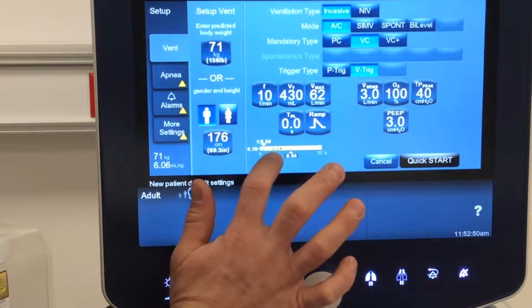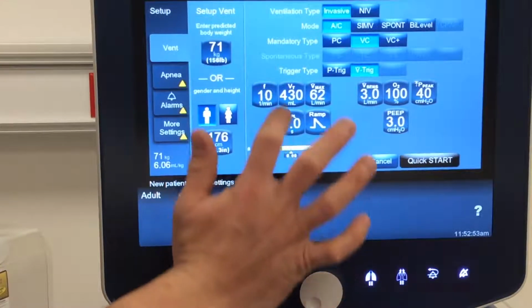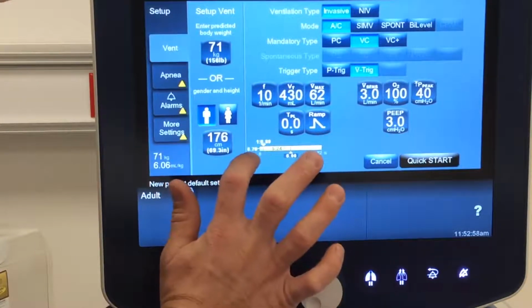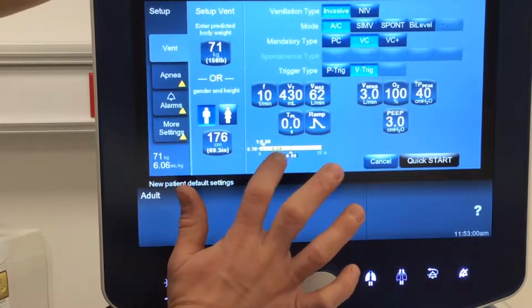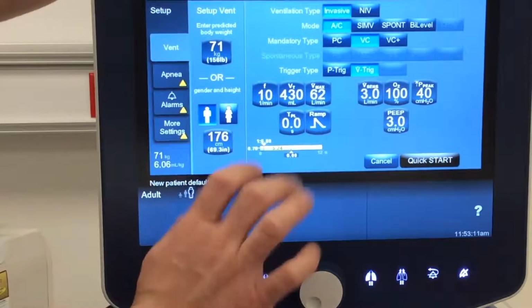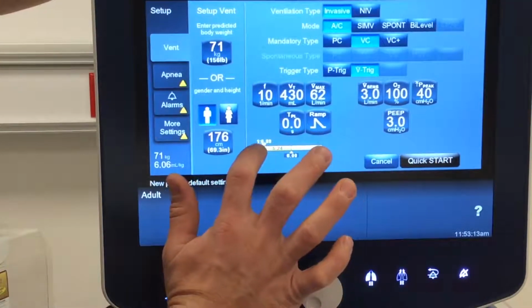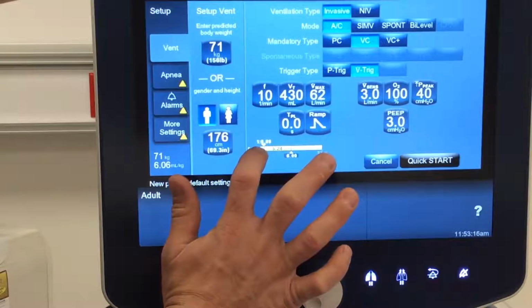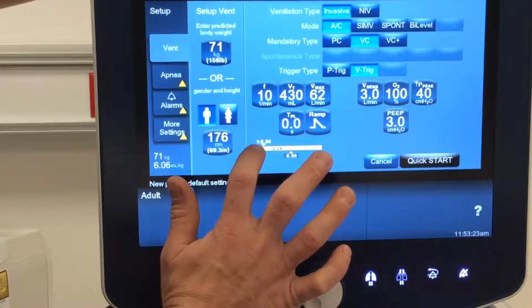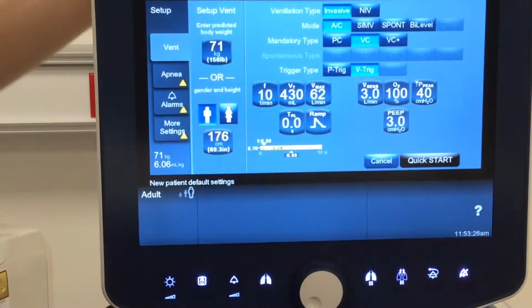Also, then we got the yellow here. So it's showing you that based upon these settings, if I start a ventilation right now, not only is my cycle time 6, my I time is 0.76, it shows me how much time I have available for exhalation. All right, 5.24. We're going to learn how to calculate inspiratory time, and we're going to learn how to calculate inspiratory time to expiratory time ratios and all that. But once again, these ventilators kind of do some of this for us. And then you can see, based upon these proposed settings, it actually breaks that down and turns it into what we call an I to E ratio.